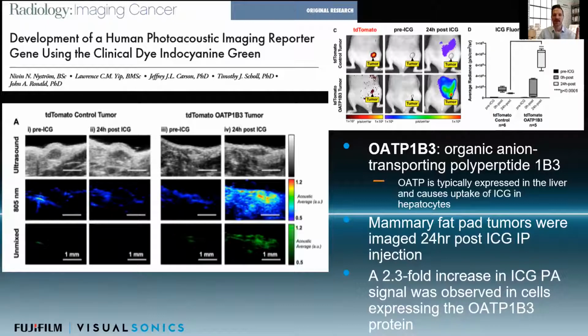The difference here is that now, instead of having these images up here, just sort of blobs on the surface of an animal, these are, again, cross sections where we can say exactly where those tumors are, what the morphology of the tissue around it is, and really go in and get that resolution at depth. So before we launch into the Q&A, Mandy, is it possible to relaunch that first poll question?